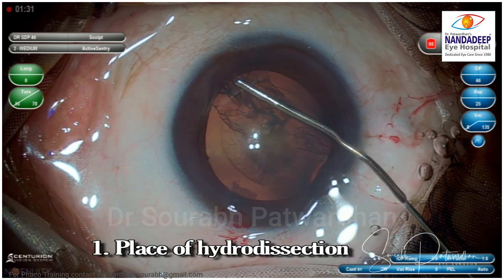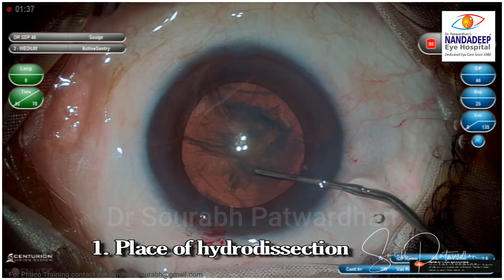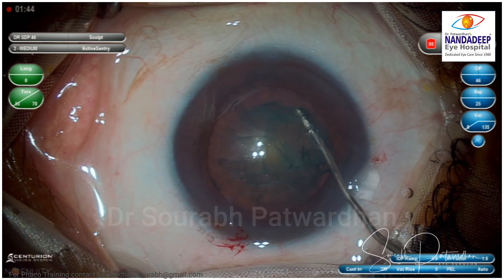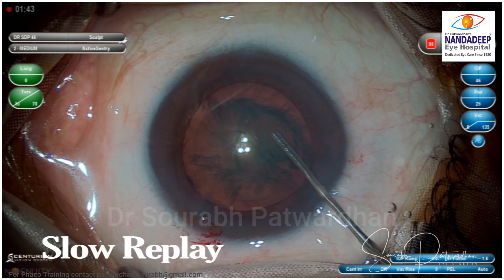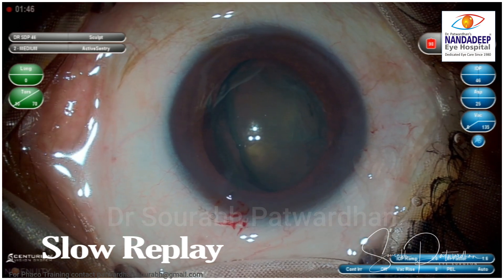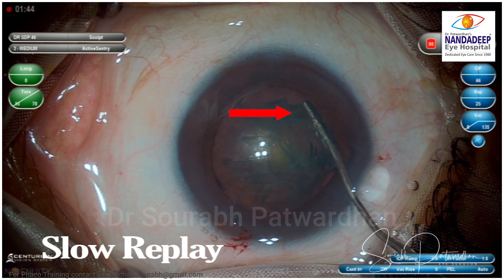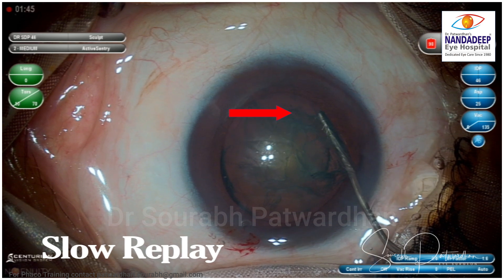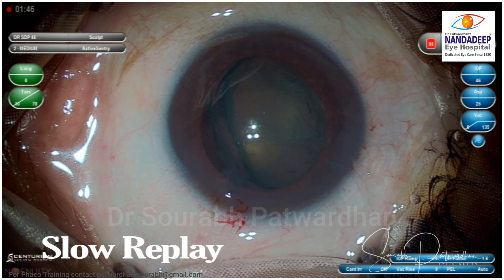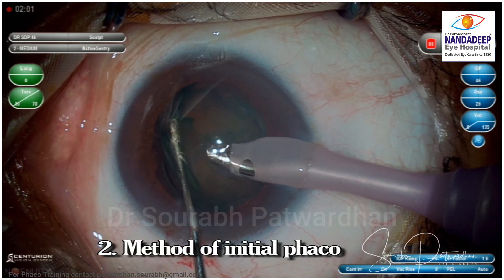The first thing I realized is the place of hydrodissection. Once we have achieved nice cortex-cleaving hydrodissection, what I have to do is push more fluid on the right side corner. If I inject more fluid in that area, I get a nucleus prolapse right in front of the incision, which is the easiest to tackle when doing the feco aspiration part. Just watch — this is the right place where you have to inject the fluid. You can do hydrodissection all around to make the nucleus free, but injecting more fluid here gives you a nucleus prolapse right in front of the feco tip.